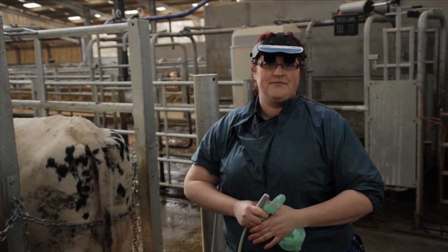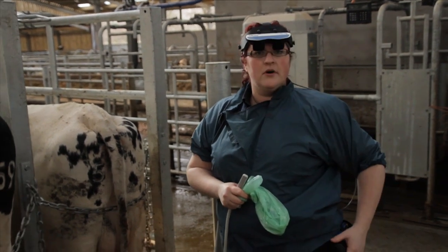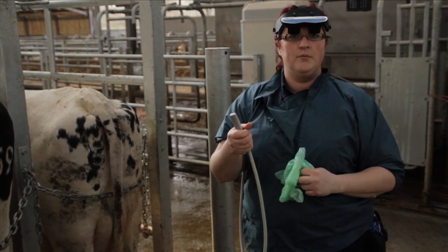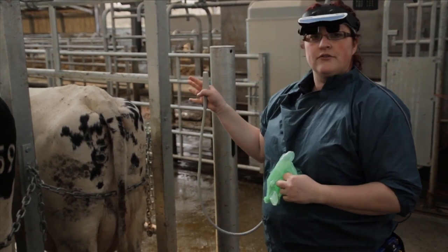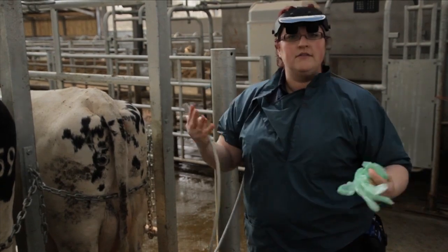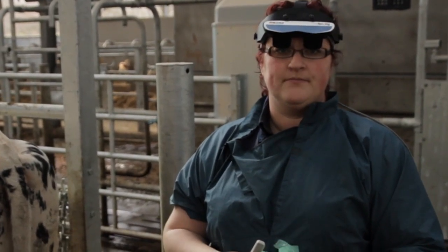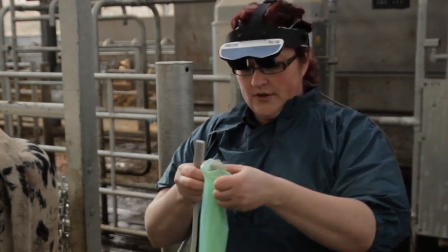Ready to get scanning. We have our console, we have our viewing device, and we have our probe. Our cows are set up. It's a nice, safe environment. Everything's nice and calm, and we're ready to go. So we'll put a glove on.